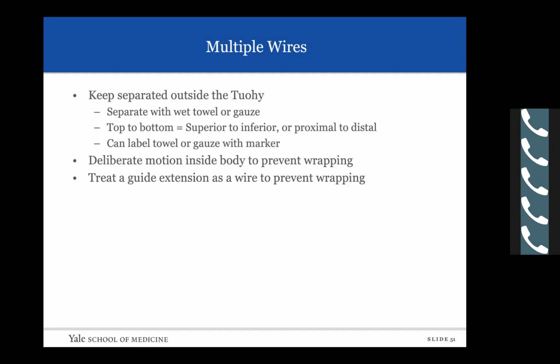And I usually just put wet towels around them and go from superior to inferior or proximal to distal, so it's very clear which wire belongs in which towel. There are people who also will label these towels or gauze with a marker to show which wire it is.